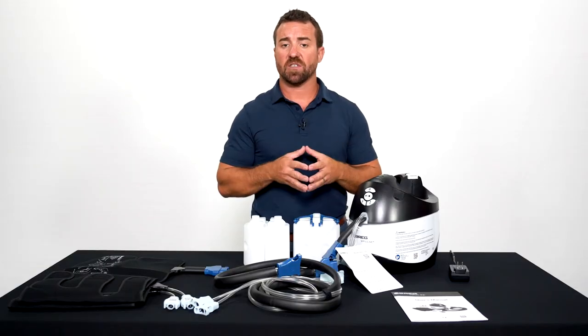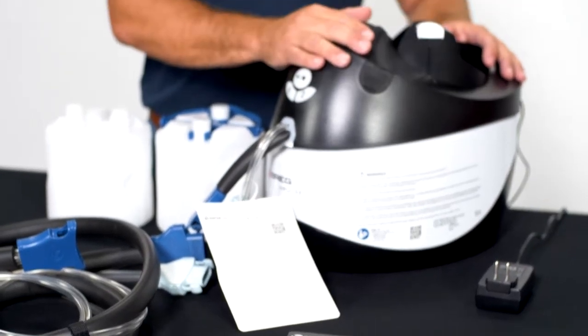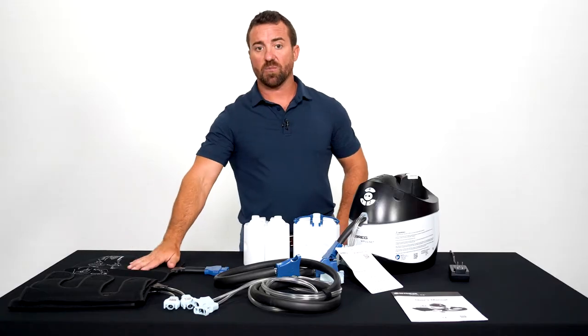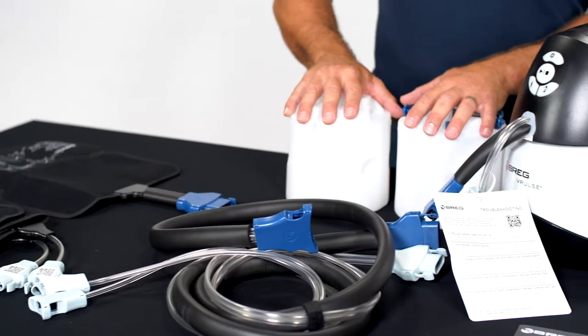Inside your gearbox you're going to have several different components: your instruction manual, your main cold compression unit, your connecting hoses, your calf wraps for DVT prevention, your cold compression wrap for your surgery site, and two sets of frozen canisters.